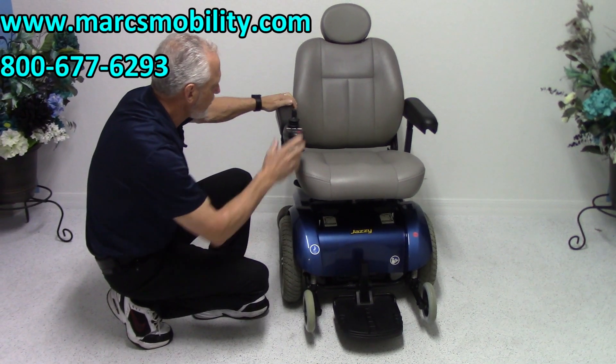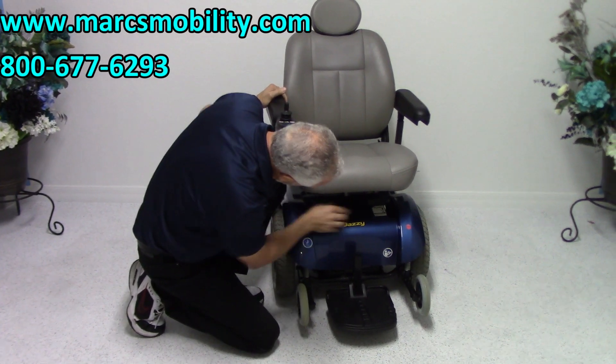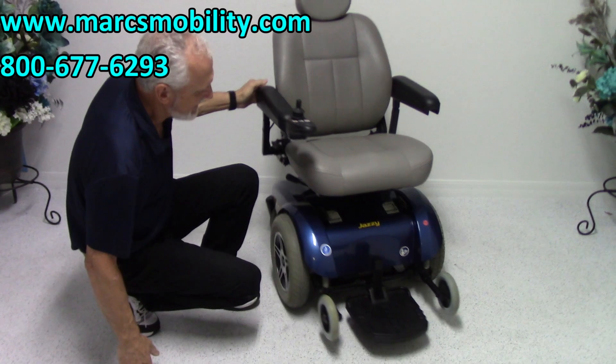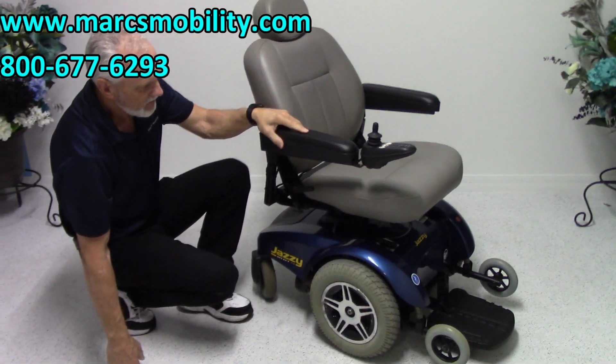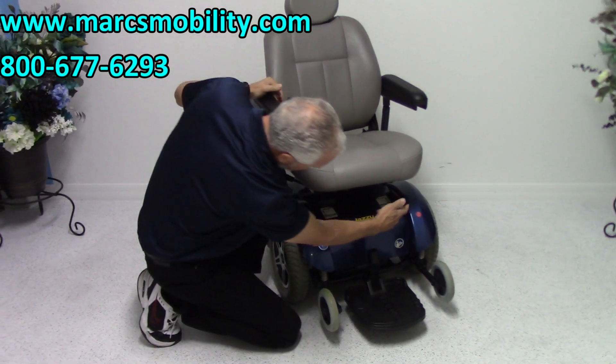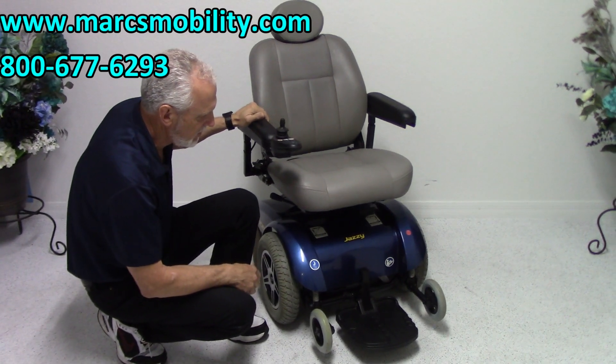When you want to put this chair in neutral, there are two levers right here. You just flip them forward — it's that easy. You can see the levers right there; that's how you put it in neutral. Flip them sideways with one finger. This is one of the few chairs you can put in neutral with just one finger.